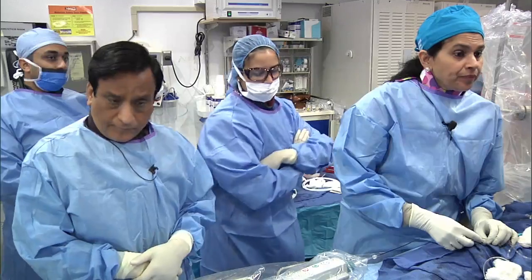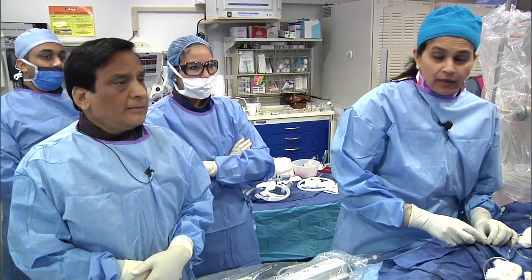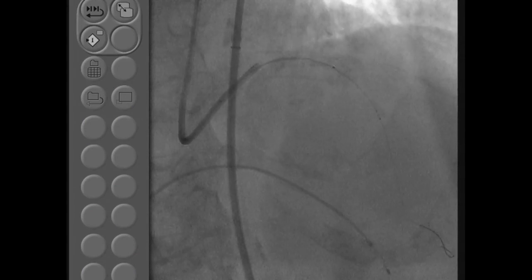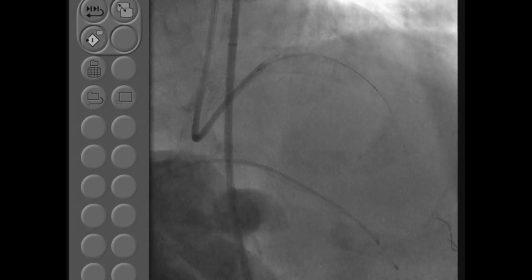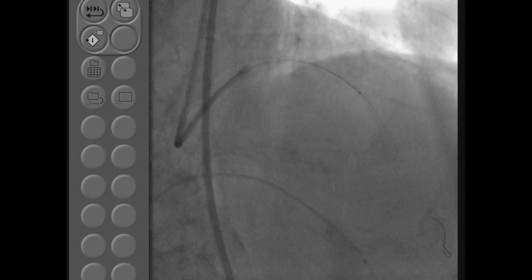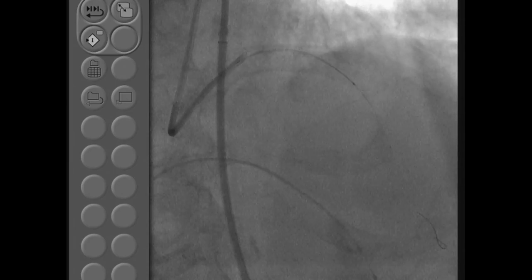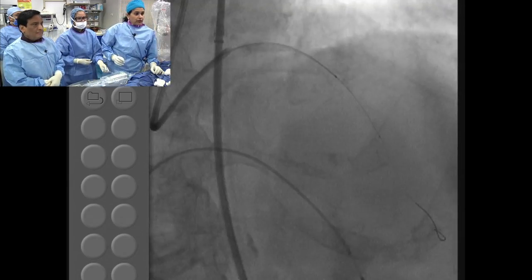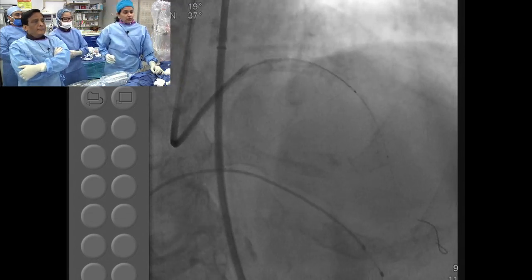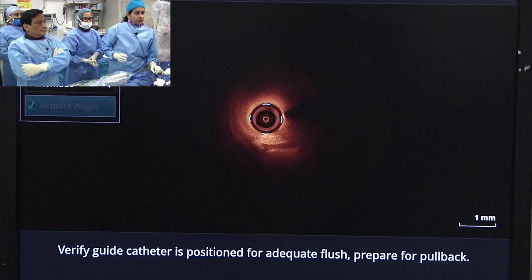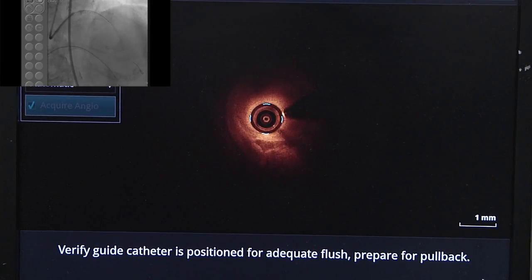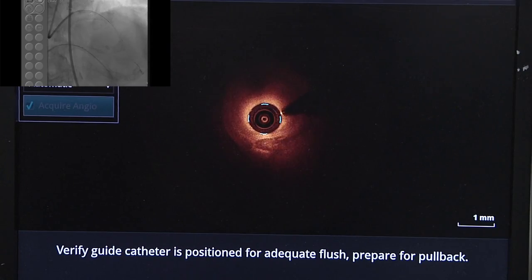Anu, are you ready? Yes — I have run a wire across the LAD and I am just going to cross the left main. So there are three markers: the distal marker, the middle marker where your optic light is, and the proximal marker which is already in the guide. Now when we inject you can see the catheter position nicely. We will do cine enable and then inject. Beautiful illustration — this is a beautiful system. Fantastic co-registration of both angiogram and OCT. You have to mark the distal and proximal marker and then it is registered.